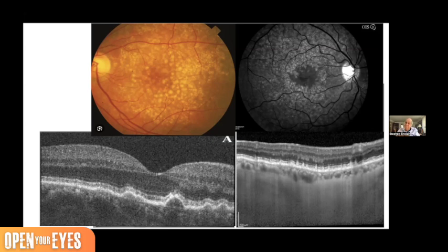Now, is that the picture on the left? Is that more of a dominant drusen, a hereditary drusen? On the left, yeah. On the left or on the right? Well, they're both inherited drusen, but they're different deposits. And with all these secondary effects that I'm pointing out, we've got to start paying attention to. And go over with us which defects are most likely to progress.